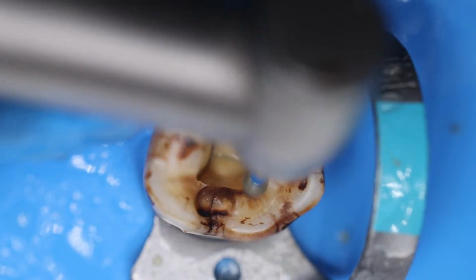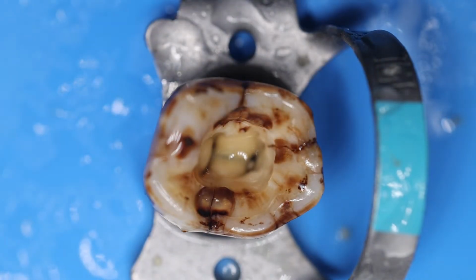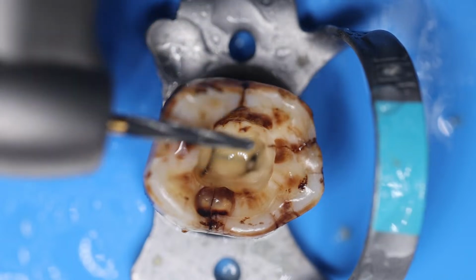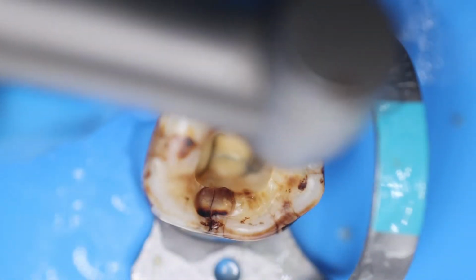See, now you can visualize that there are some orifices. Okay, once you are able to visualize that there are some orifices, you can switch on to the endo Z bar. This is the endo Z bar. Now we can just refine the access cavity shape with this bar.